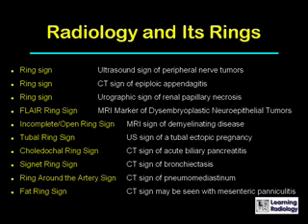Radiology loves its ring signs, and here are the names of 10 ring signs that are used in imaging for you to look over.